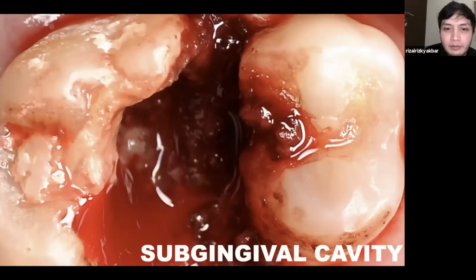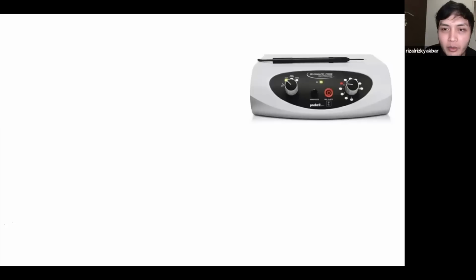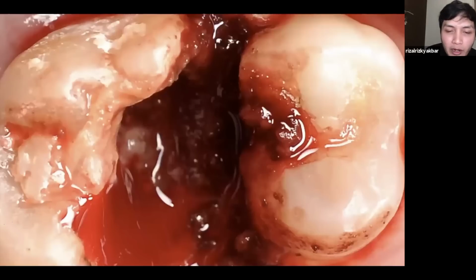clearly. This subgingival cavity, basically what you need to do is to make sure that you have space to put the rubber dam. The common mistake is that sometimes you are in too much of a hurry to place the rubber dam without realizing that the cavity is really deep. So the next thing that happens is you take off the rubber dam and then you do a gingivectomy after that. Make sure that you have proper space to put the rubber dam. Don't be in too much of a hurry to place it.